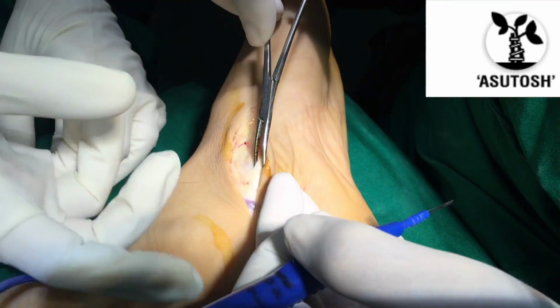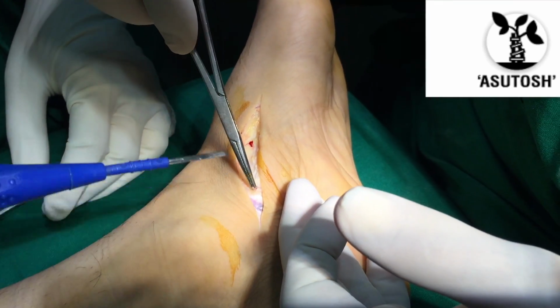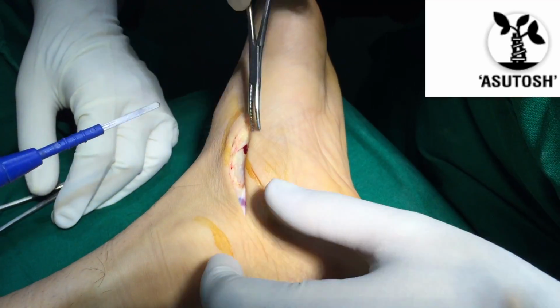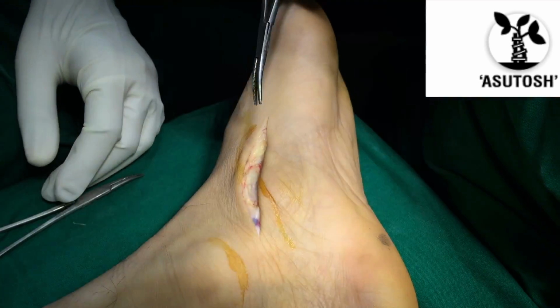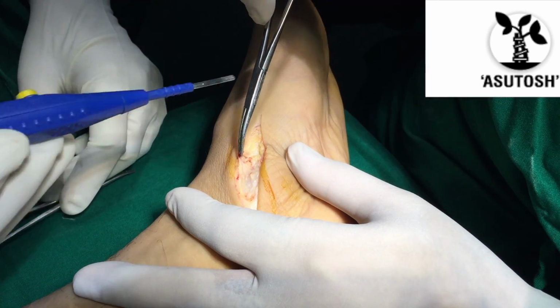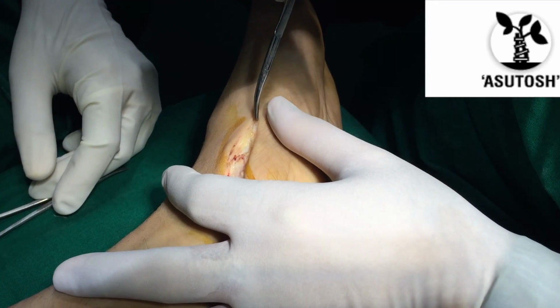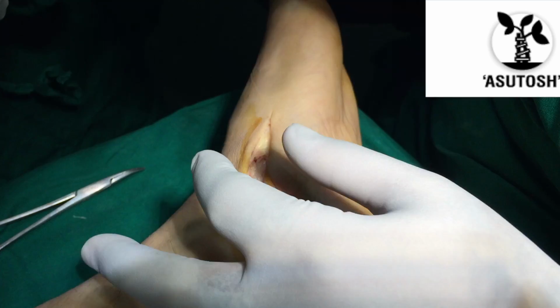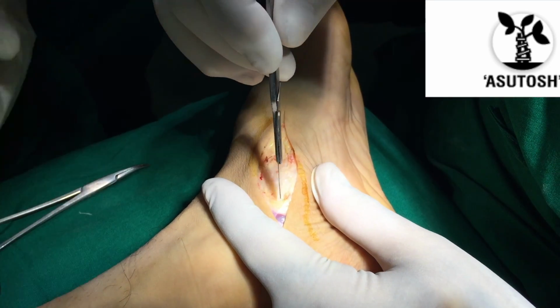We can see one bleeder in the proximal region of the incision, and we plan to preserve that vessel. It's a communicating branch that we plan to preserve, and we are coagulating the remainder of the veins, the branches that we can see.